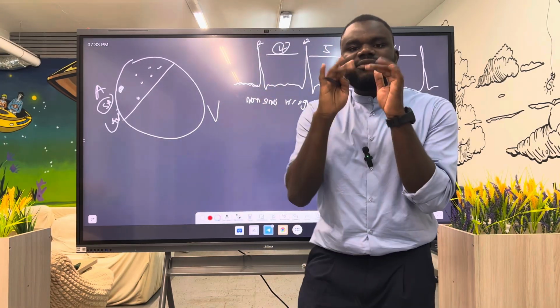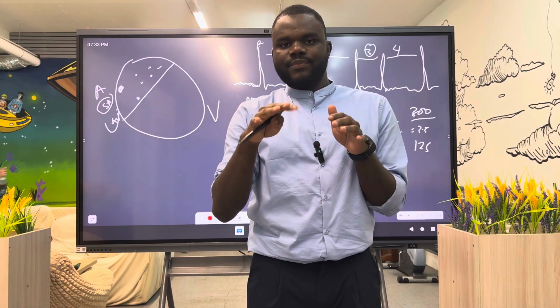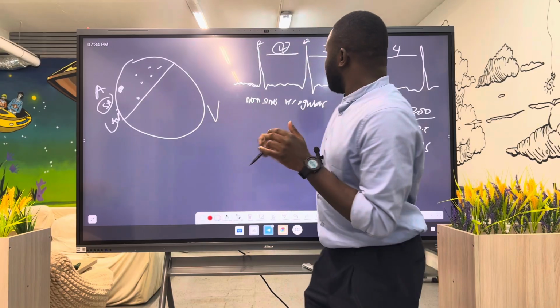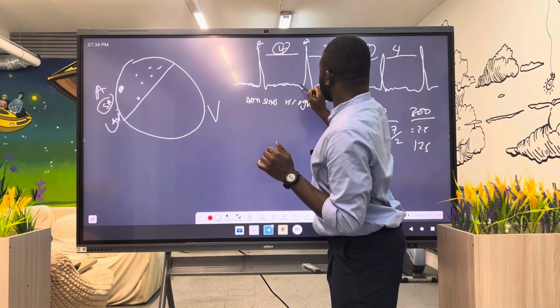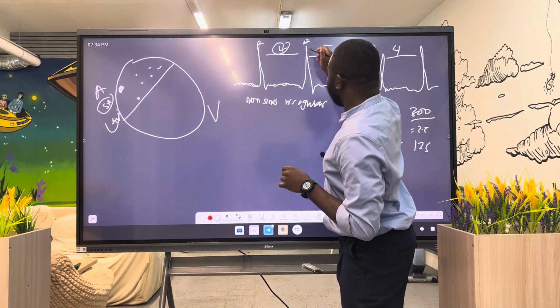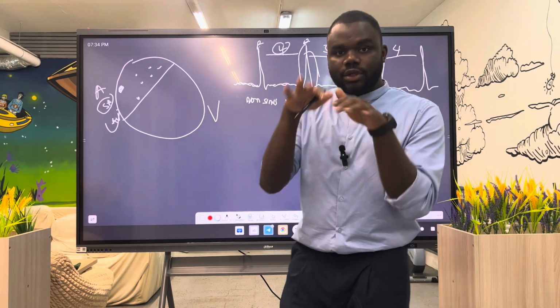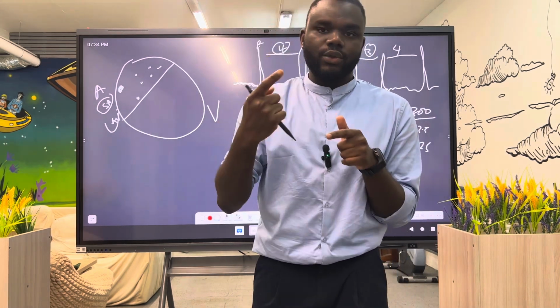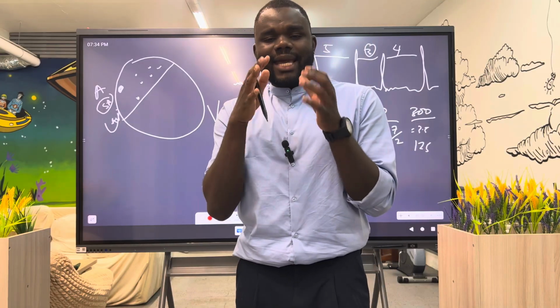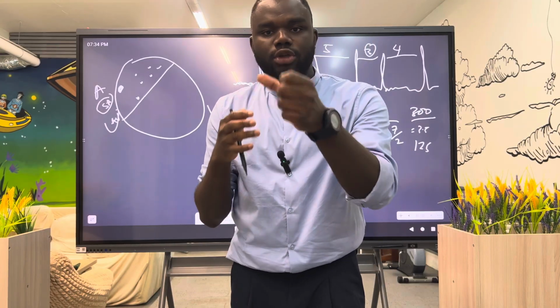These waves are known as fibrillatory waves. It's contracting very, very fast. So you might have 20 contractions of the atrium before you have one ventricular contraction. So that's super fast. But the thing is that the heart is contracting, but the heart is not pumping.